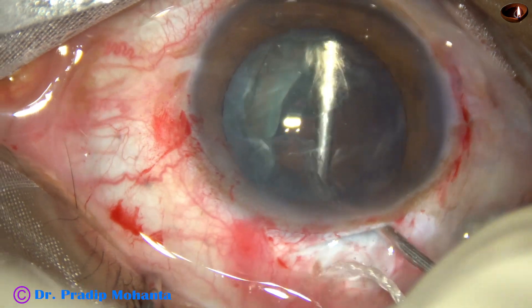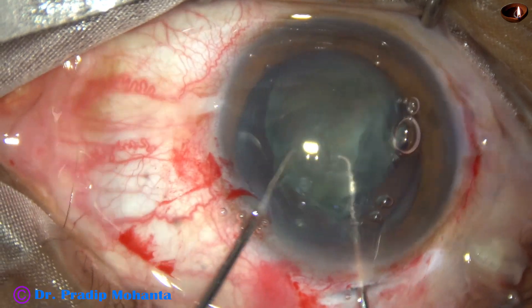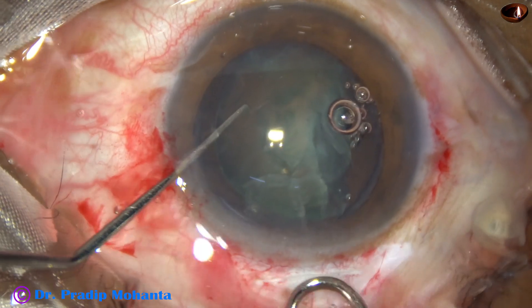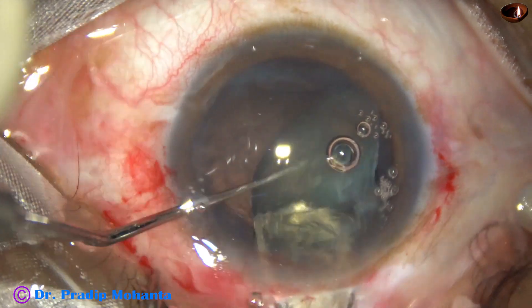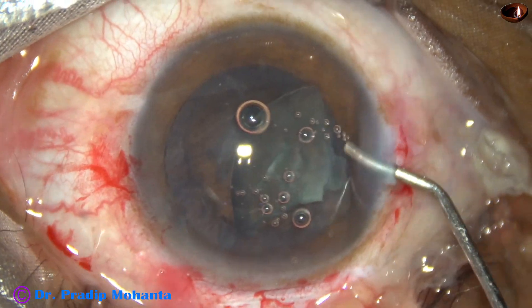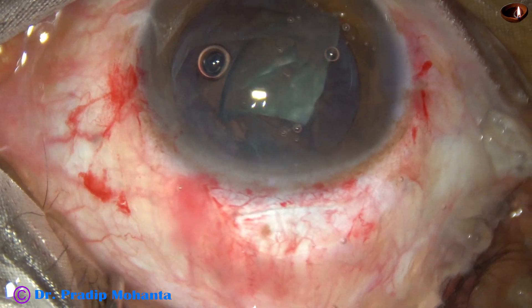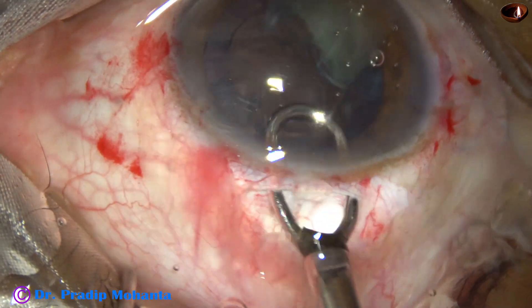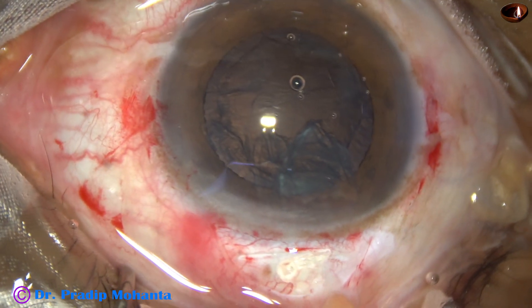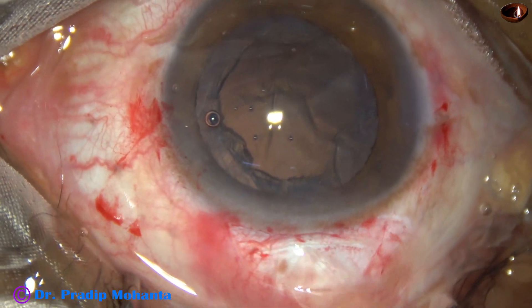Again I inject visco. This hemi-nucleus has to be removed now. With the help of the two hooks, I bring it out of the bag and orient it. Using the vectis, but again it breaks. Now I inject visco again. I place it in such a way that it engages easily into the tunnel, and this time it comes out easily. Inject visco again, depress the posterior leaf, and this portion of the nucleus comes out.